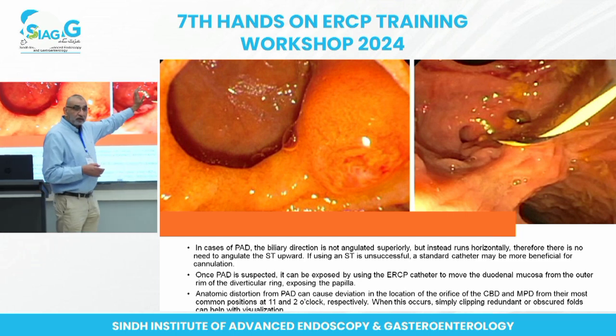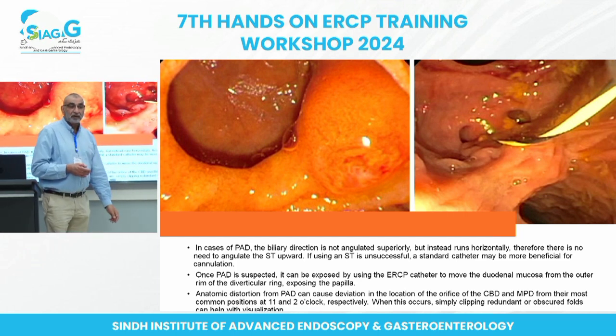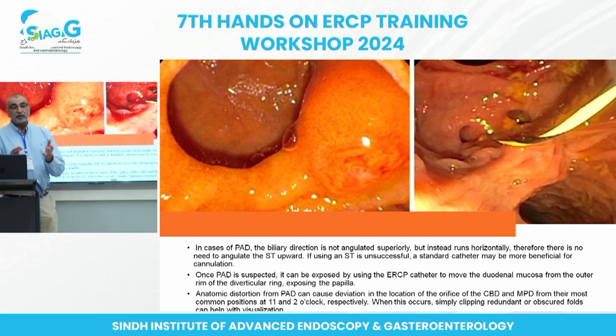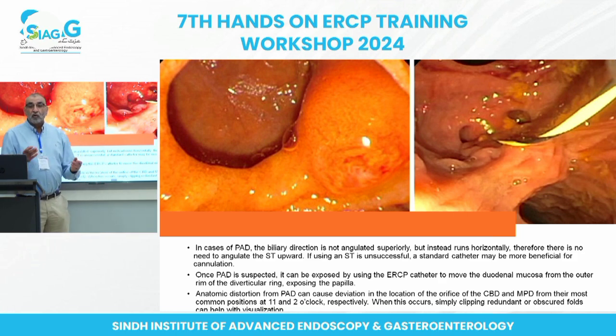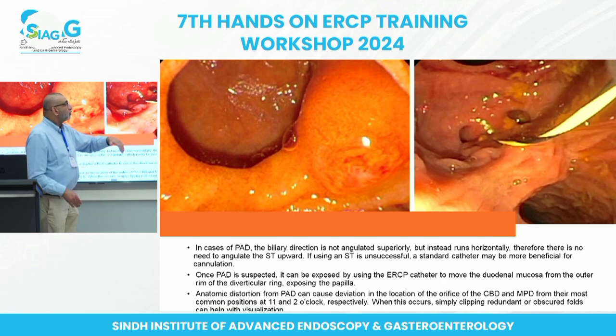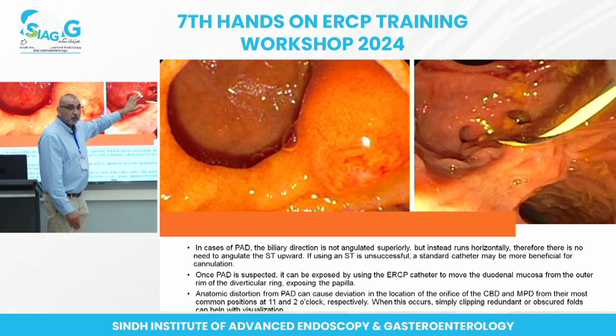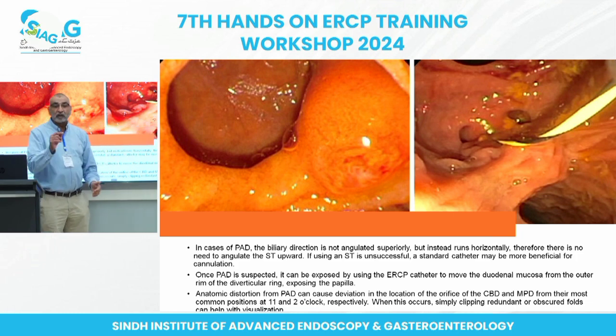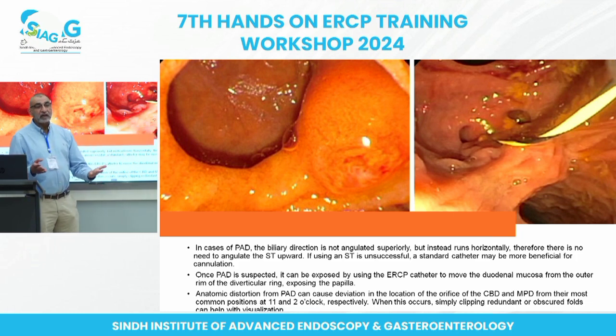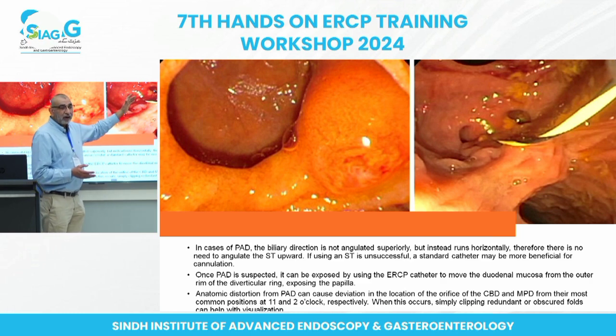The problem arises with the papilla which is inside the diverticulum. Those are more challenging. You can change your position, you can adjust your thing to bring your scope into position and try to cannulate from outside, लेकिन it is always challenging. उसमें ये कर सकते हैं कि there are a few options. One of the options is some people use injection submucosally. Saline या कुछ inject कर लेते हैं यहाँ पे इसके side पे, and that pushes the papillary orifice out for you, so you can cannulate it. I don't quite like that method क्योंकि उसमें ये होता है कि it's not all that effective and might close your orifice को compress कर देता है.